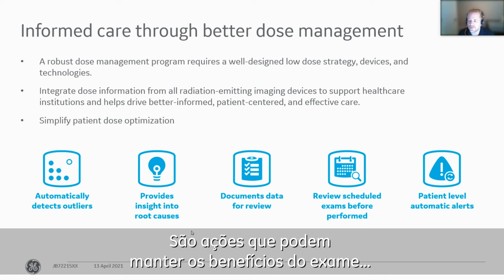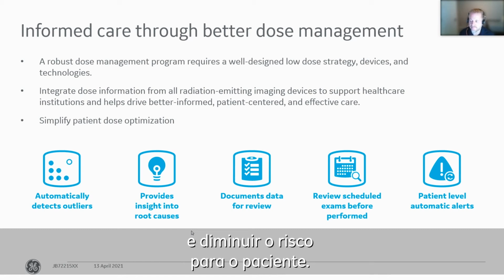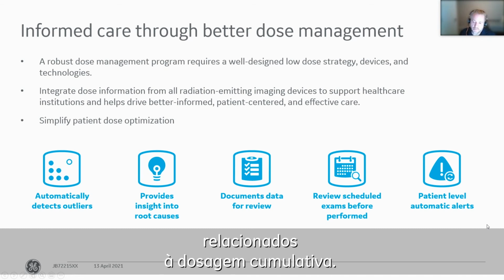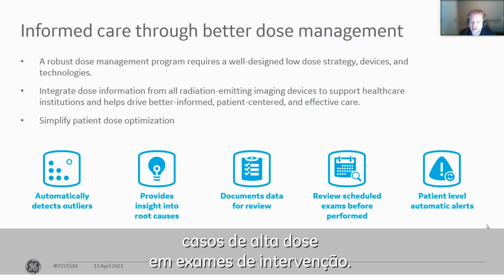Things that you can do to still get the benefit of the imaging exam but decrease risk for the patient. And certainly they can give you patient-specific alerts related to cumulative dose. And again, the example here is high-dose cases in interventional imaging.